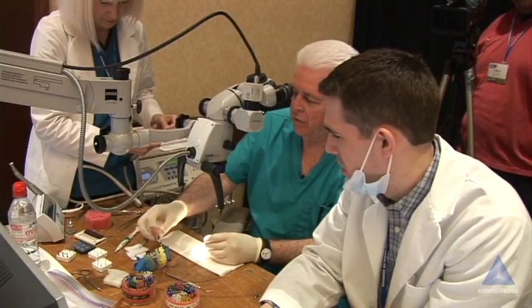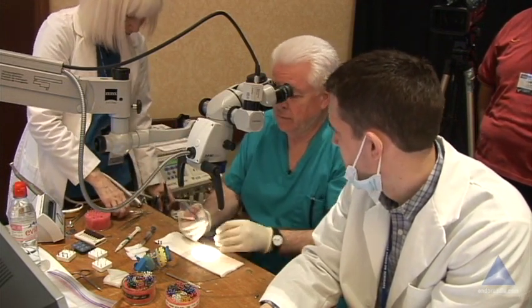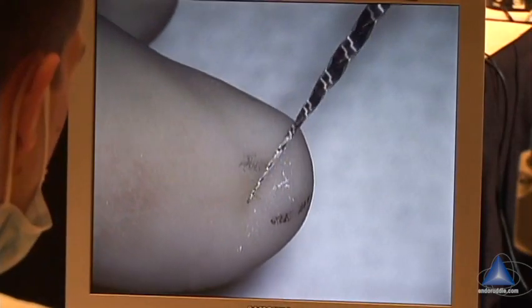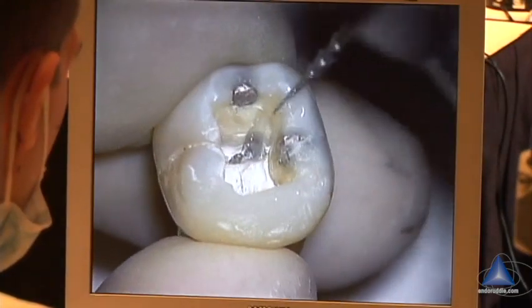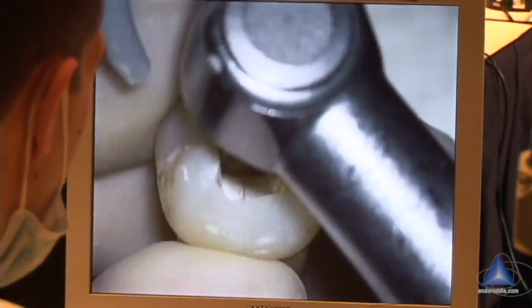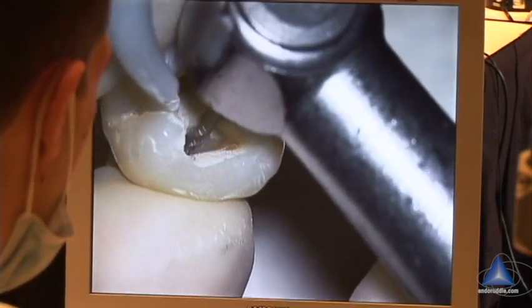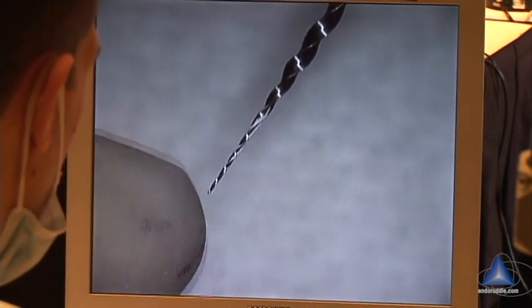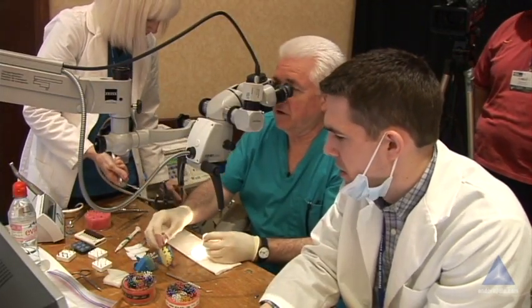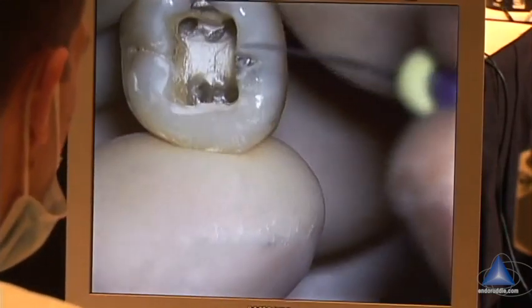Give me an SX real quick — we could do it with an SX. I don't know what kind of work you have. I haven't done anything, Justin — so I'm living right on the edge, cutting dry. When you pull these out you can always tell you're working. It's pretty clean on the last two, a little bit of debris more up in there. That's better. So you can see how access is so important.